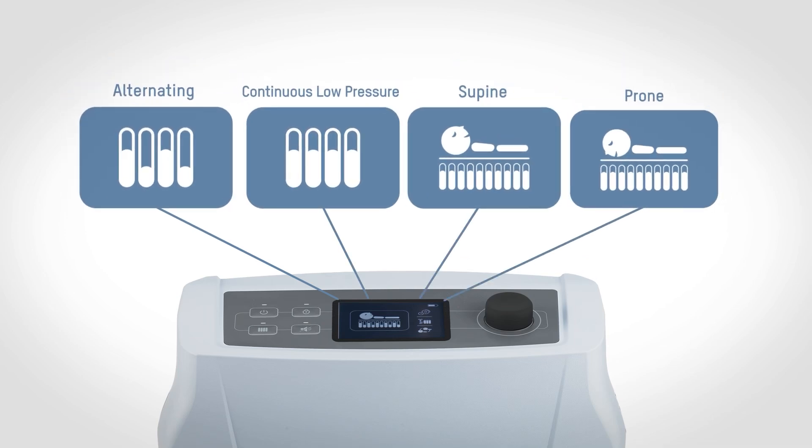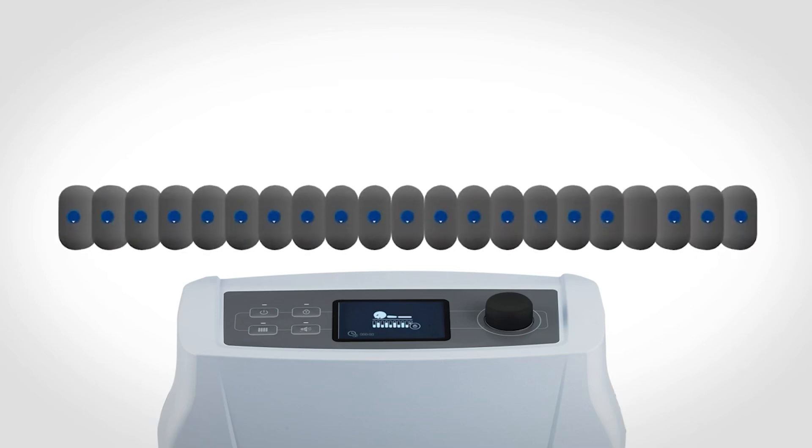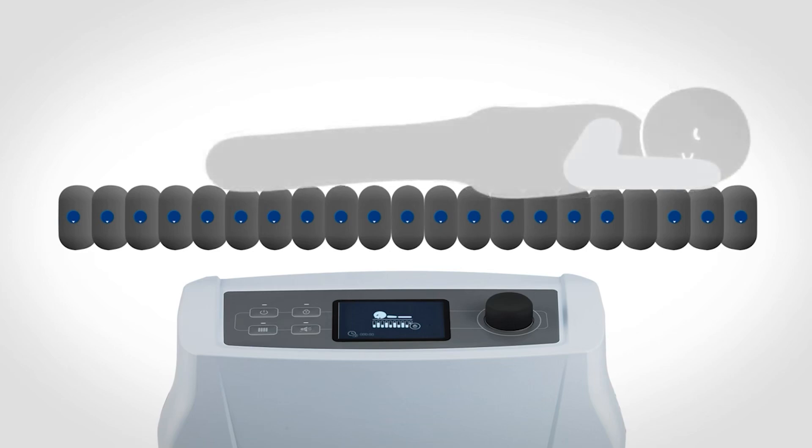Alternating and continuous low pressure modes in both the supine and prone positions are available with an easy click. After selecting the prone position mode, more functions become available to assist in carrying out difficult tasks. The pump will start to inflate the mattress to the maximum level to facilitate repositioning of the patient from the supine to the prone position.